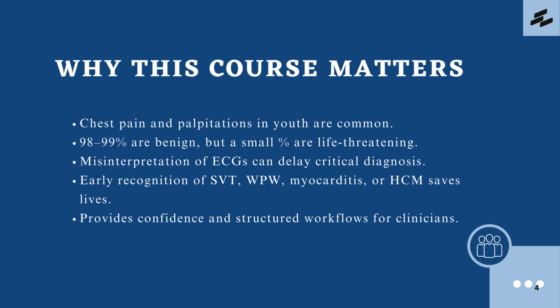Why this course matters. Chest pain and palpitations in young people are common, but the majority are benign. However, a small percentage represent life-threatening cardiac conditions, such as supraventricular tachycardia, Wolff-Parkinson-White syndrome, myocarditis, or hypertrophic cardiomyopathy. The challenge lies in separating the benign from the dangerous. Misinterpreting ECGs by applying adult rules to children is a common pitfall. This course provides a structured, practical approach so that serious cases are not missed and benign cases are not over-investigated.